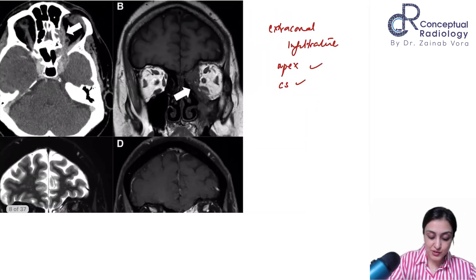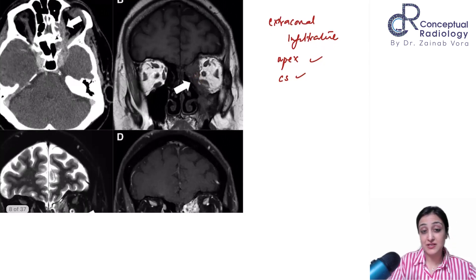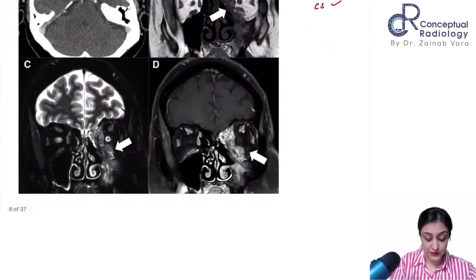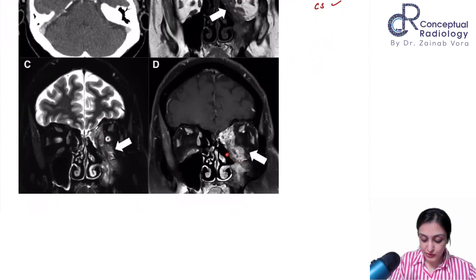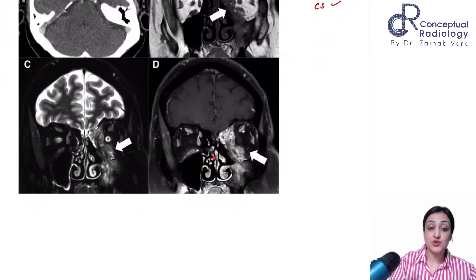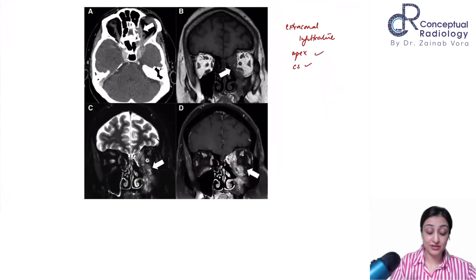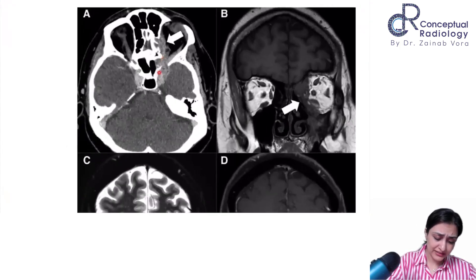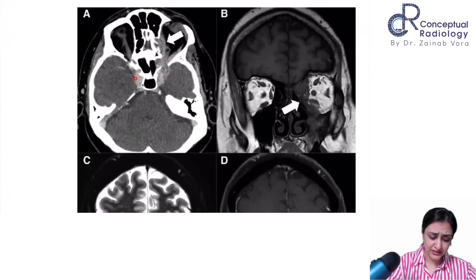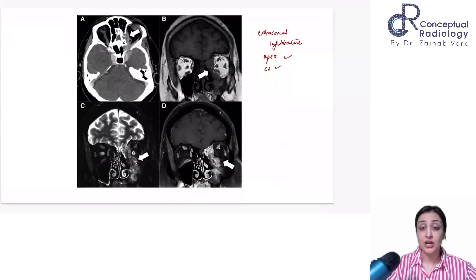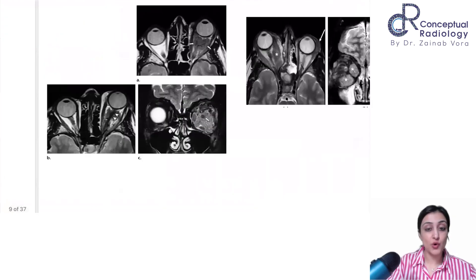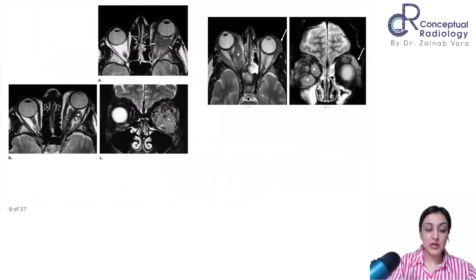The mass encases different muscles, particularly the medial rectus. On T2, it extends into the floor of orbit and out into the infratemporal fossa. It is infiltrative with bilateral cavernous sinus involvement, more on the left side — both sinuses look a little bulky. This is orbital pseudotumor.